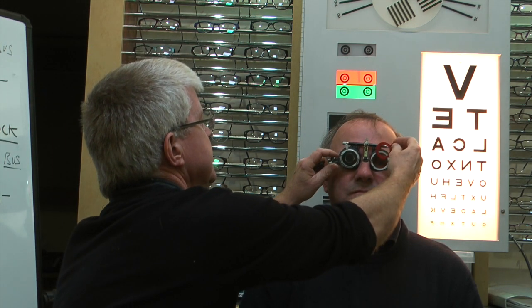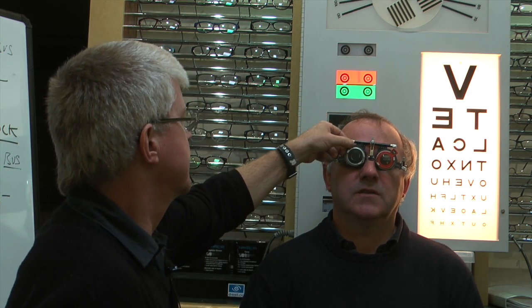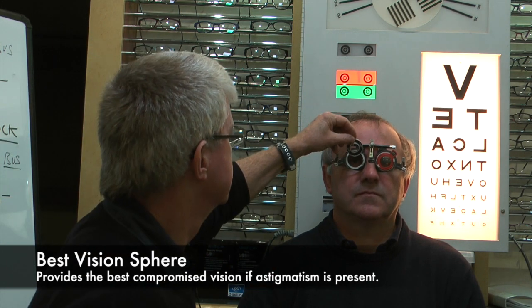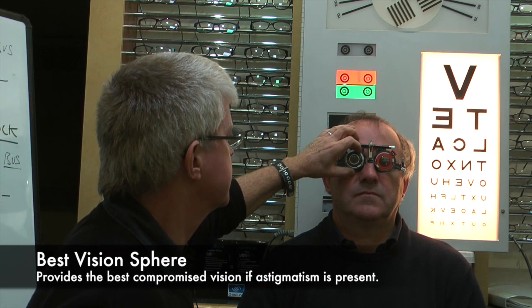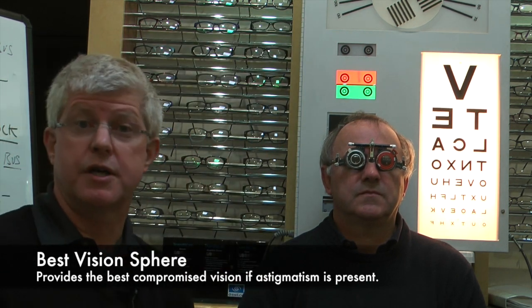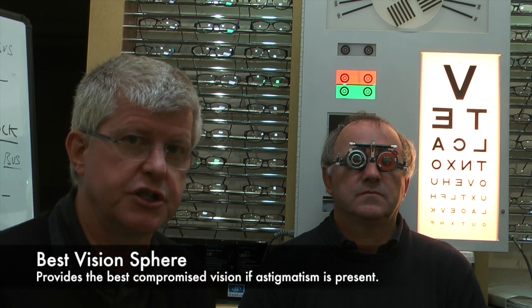So we're going to end up now with a minus 1.75 in the left eye as the best vision sphere. So we're going to put a minus 1.75 in there. Dead equal now. So we're going to remove this occluder, and I'm going to put what we found in the other eye, which was a minus 3.25. So we've now got the best vision sphere in place. Remember, when the best vision sphere is working, it means that the circle of least confusion is on the retina, and that gives us the best compromised vision with a spherical lens.